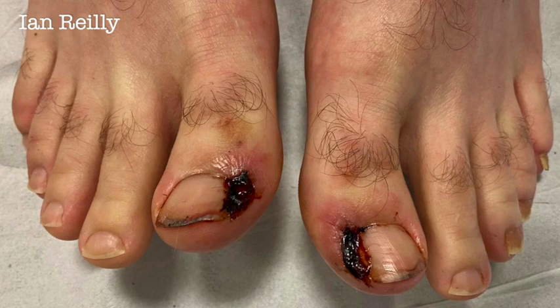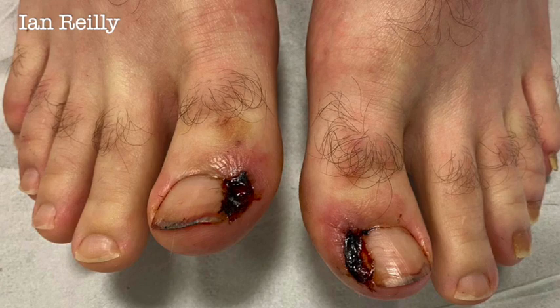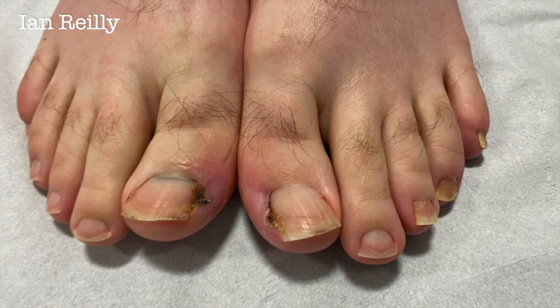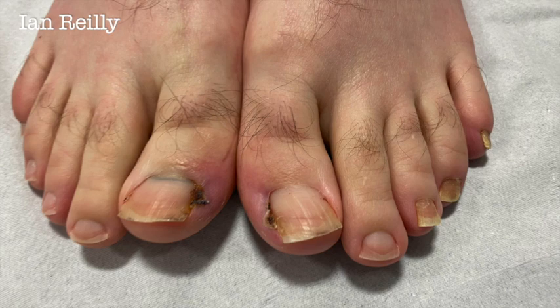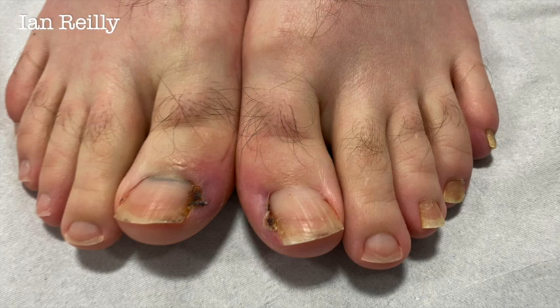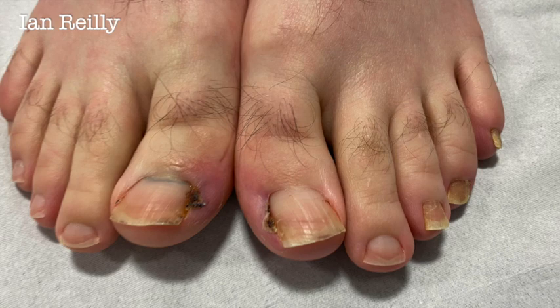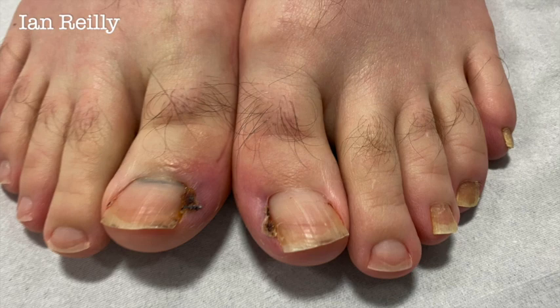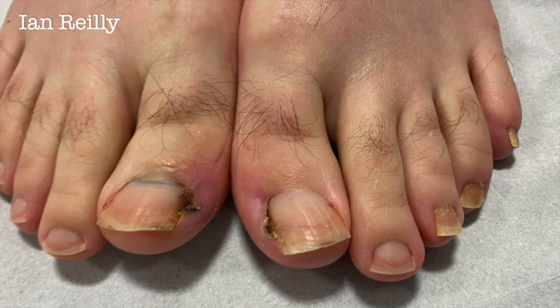Our patient came back about a week later. You can see it's a deeper wound — the patient had a little bit of strikethrough and bleeding, so in many ways it's a more aggressive wound than we would have with our normal phenol technique. But it's a clean wound. It heals by secondary intention, but you don't have that phenol burn, so it's horses for courses really. There's a difference between that phenol burn which takes quite a few weeks to heal and this more acute wound, made a little bit worse by the electrocautery used. Then this is the picture six weeks later. He actually had bilateral procedures, but because of the camera angle, it really only showed the right first medial sulcus. The right one was a little trickier because there was a bit of scar tissue in the medial sulcus from the previous partial nail avulsion, and that was the one that bled a little bit. Basically, what was previously hypertrophic skin has flattened. So it's a deeper wound — in some ways a little slower to heal than phenol — you get quite a deep graze. But it's a good option.